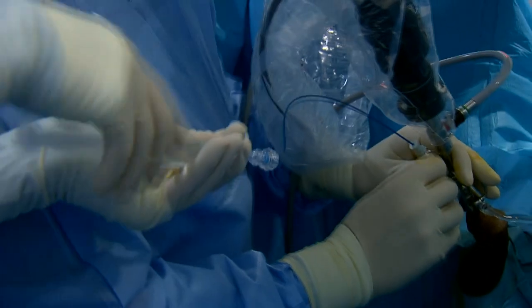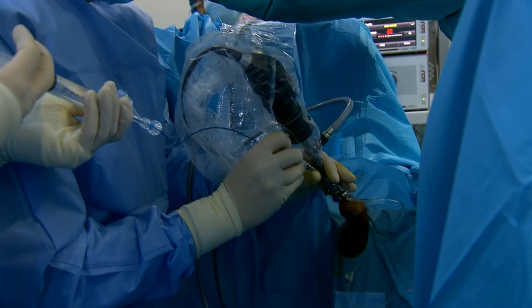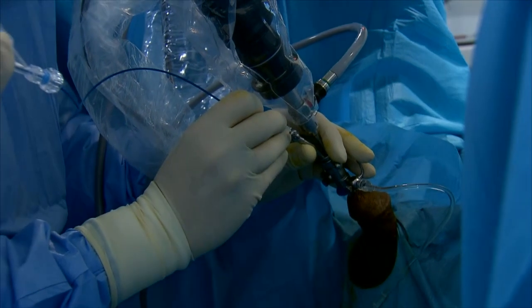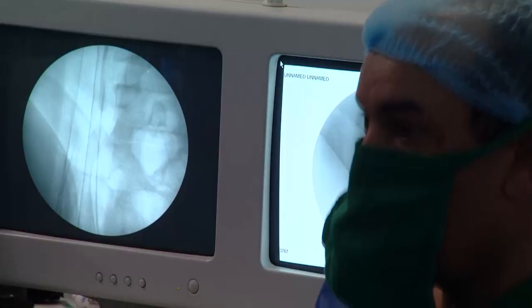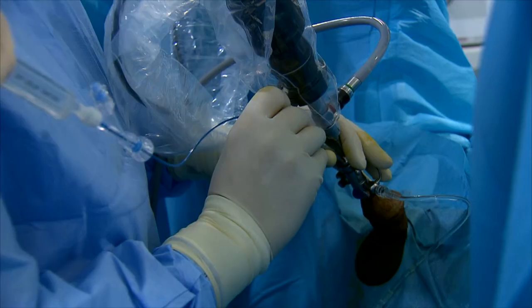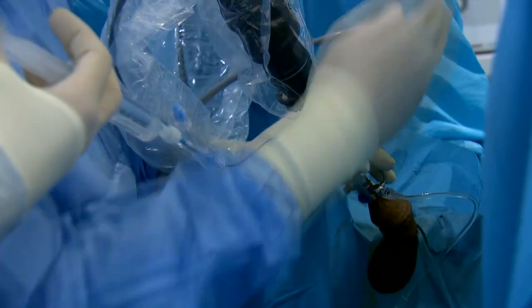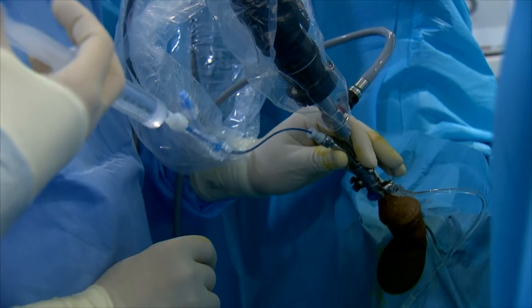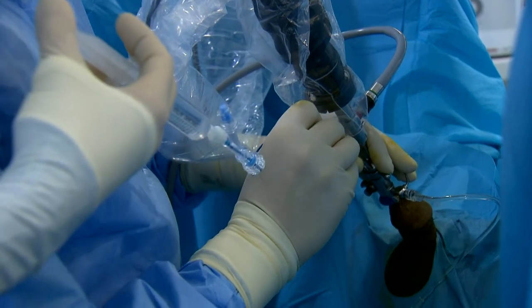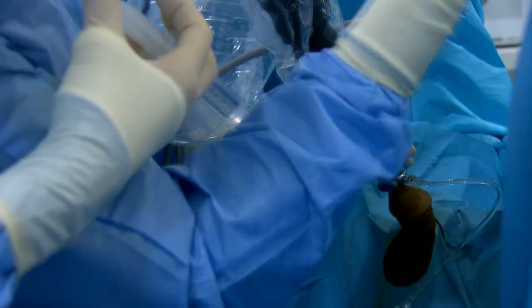The next step is to perform a retrograde pyelography in order to exclude any pathologies of the ureter. Now, X-ray, please. More. Continuous, okay? Stop. Now move up to the kidney, please. Continuous X-ray, please. Yes, stop. Now kidney, please. Once more, please, X-ray. No, it's too far. Please push the kidney in the center of the image, which means the X-ray arm. Yes.